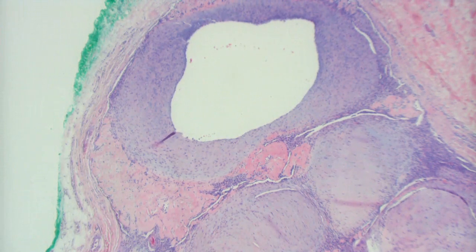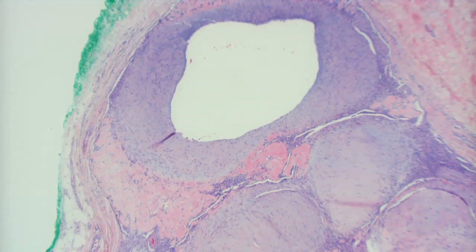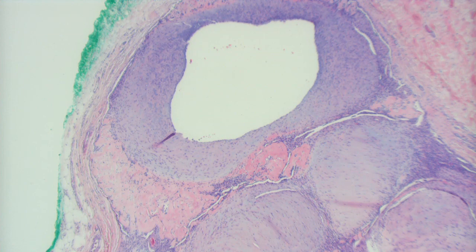But they're very interesting. Sometimes they can be multiple, sometimes they can be single. When they're in adults, they're usually solitary. When they're in kids, they can be multiple. Usually not painful, but sometimes they can be if they contract, like leiomyomas. They can sometimes be a little painful. So you don't have to remove them. Conservative excision. They almost never turn malignant. So a very nice example of that. It's great that you're able to nail that diagnosis so quickly.